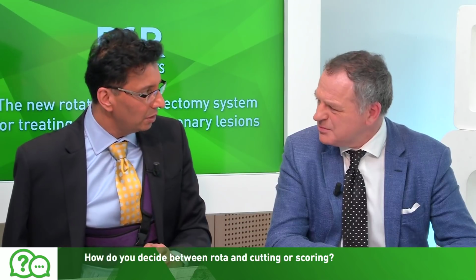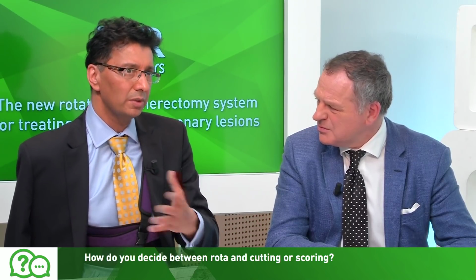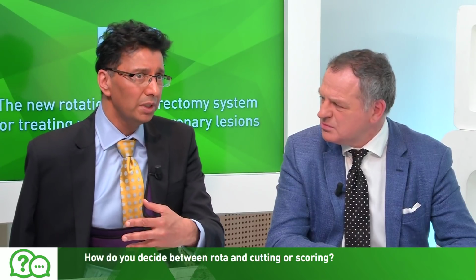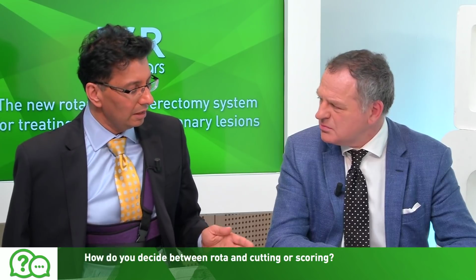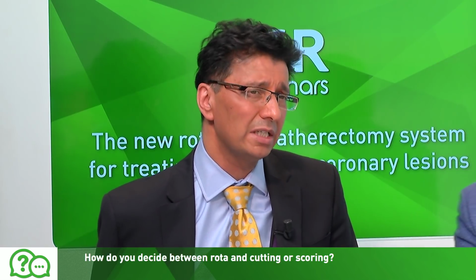If after you have burred and exhausted your burr options through that guide, and you don't want to use an alternative access with a larger burr, then it's entirely reasonable to employ a scoring balloon or cutting balloon after you have burred, rather than going to another access. But coming to the question as to whether you would use it as an alternative, I favour not. I think rotational atherectomy is a more predictable strategy.